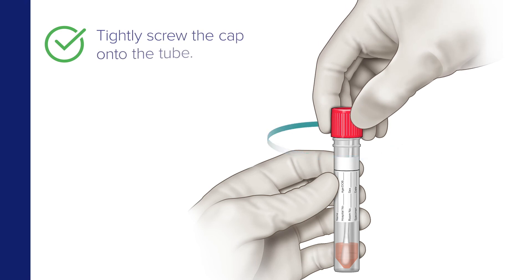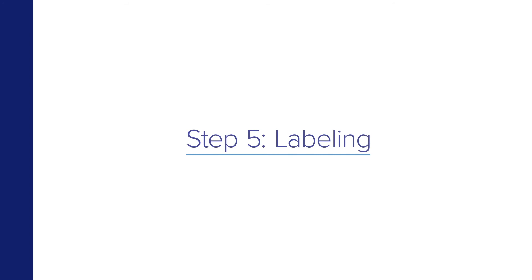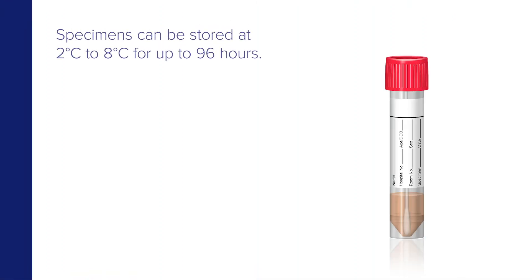Now tightly screw the cap onto the tube. Use the tube label to provide a unique identification of the specimen. After collection, specimens can be stored at 2 degrees to 8 degrees Celsius for up to 96 hours.